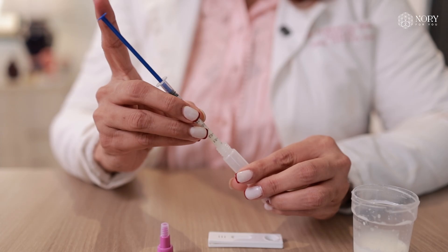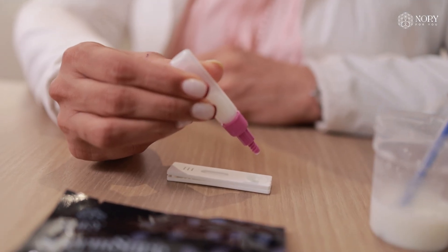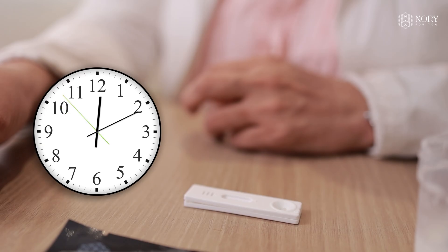Here is how to use this sperm kit step by step: collect the semen sample in the collection cup provided. Avoid testing if you had a fever in the past 1 week or haven't abstained from ejaculation for 2 to 7 days. Mix the sample with the dilution buffer provided in the kit. Use the dropper to place a few drops in the test cassette and wait 5 to 10 minutes for the result to appear. Read the result as per the instruction manual included in the kit.